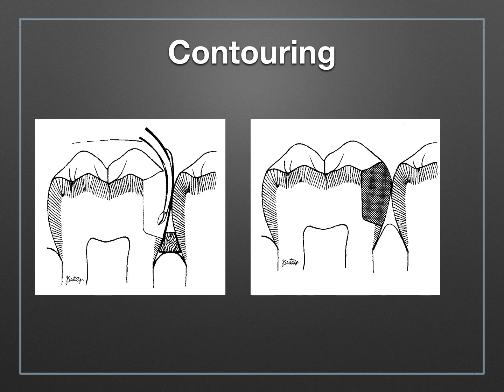Here's an example showing the location of the wedge after placement. You can see it's not entirely located gingival to the gingival margin, but it's not impeding into your box space.